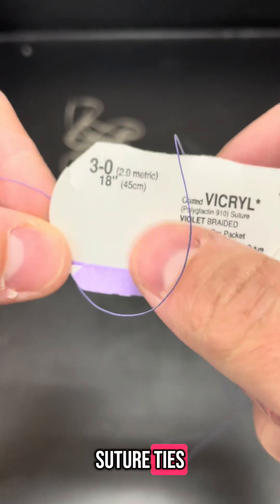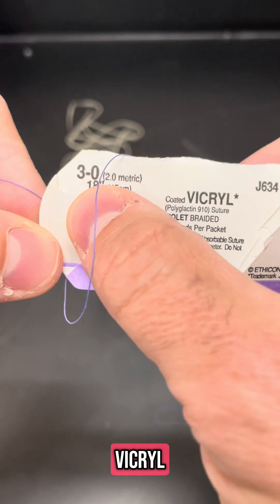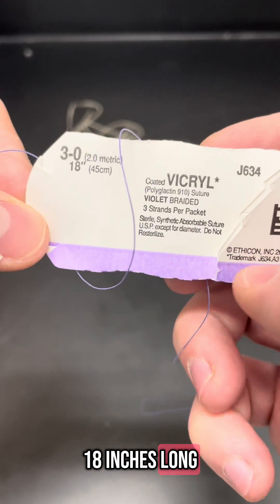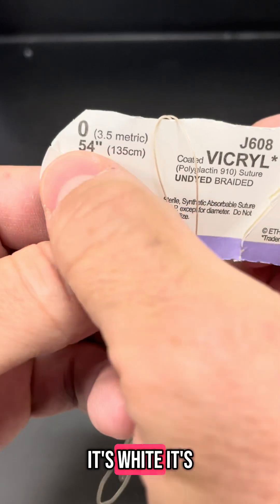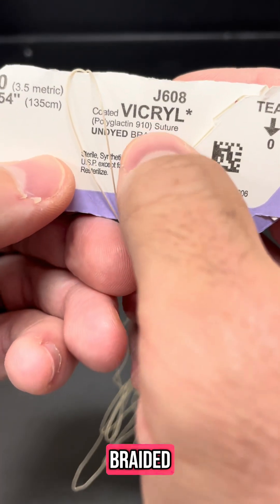These are just suture ties. Violet, braided, 3-0 vikryl, 18 inches long. Zero vikryl, undyed, which is why it's white. It's 54 inches long, and all vikryl is braided.